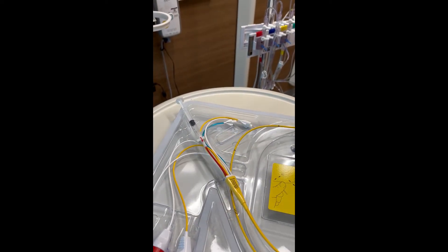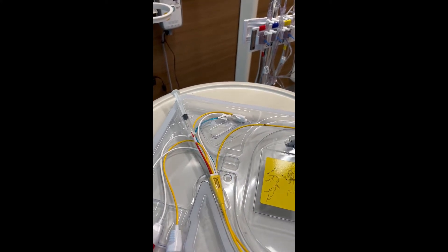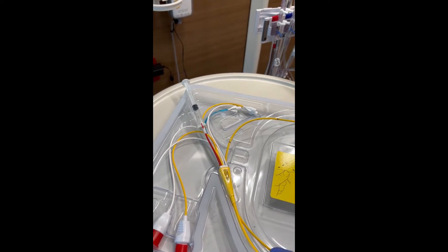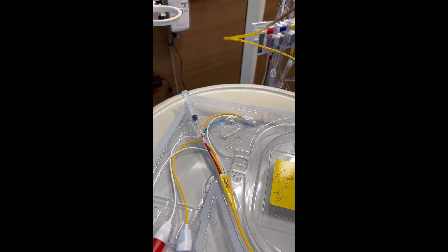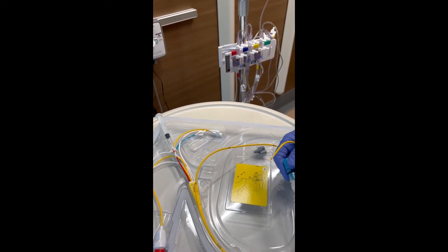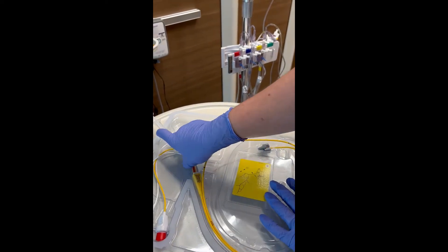So when the physician is ready to insert the Swan, if you're using a C-arm, fluoroscopy will be here with it. But he'll be sterile and he's going to hand you the Swan with the sleeve already on it. He'll be handing you these ends.